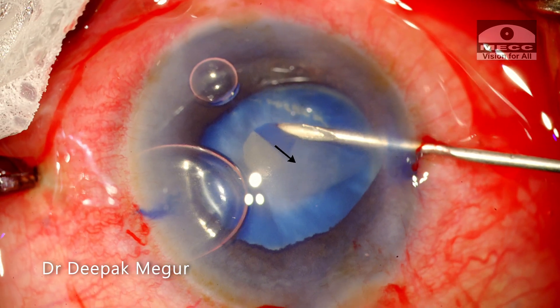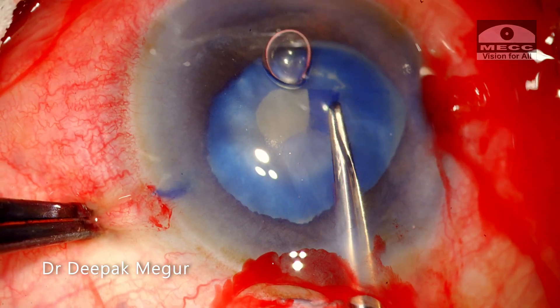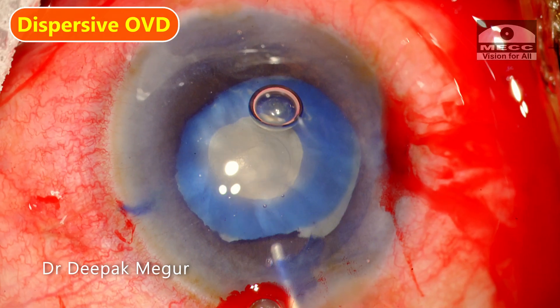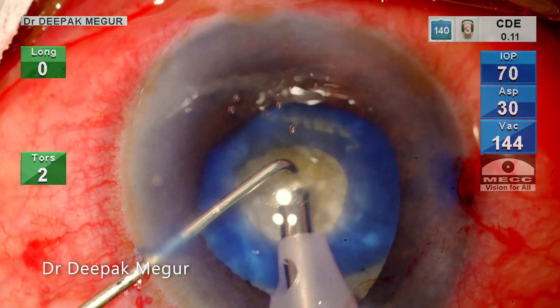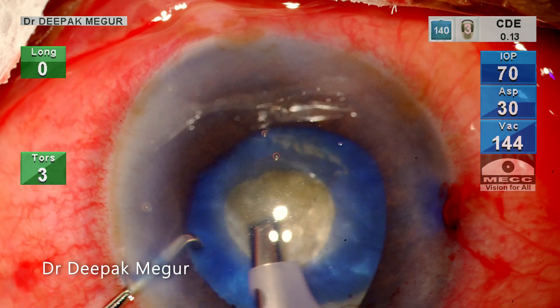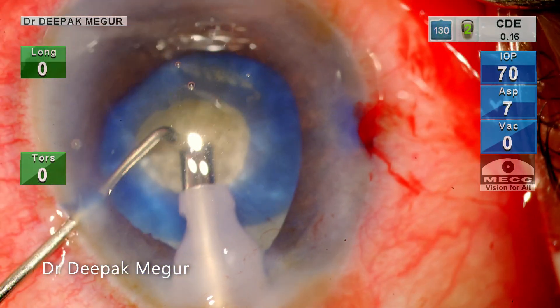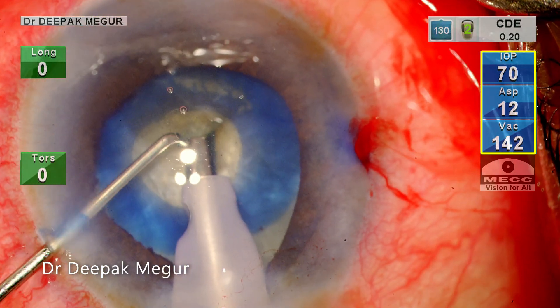There is some liquefied cortex which results in some amount of passive decompression. I'm using a forceps to do the primary mini-rhexis. The iris is flabby and is trying to come out of the incision. The dispersive OVD is used to put it back in place. I'm using my phaco tip to decompress the bag. The dialer is used to nudge the nucleus to release some of the trapped cortex beneath the nucleus, and in a couple of moments a decent amount of decompression can be achieved.